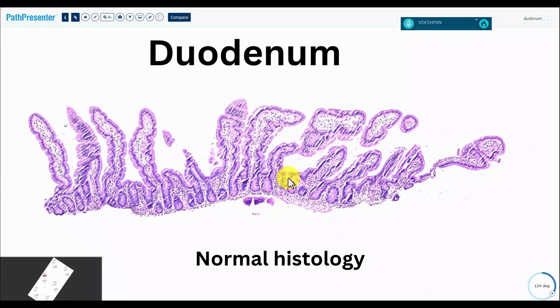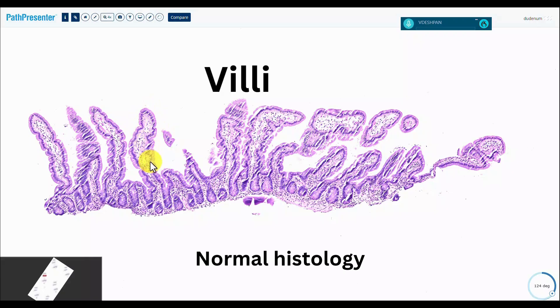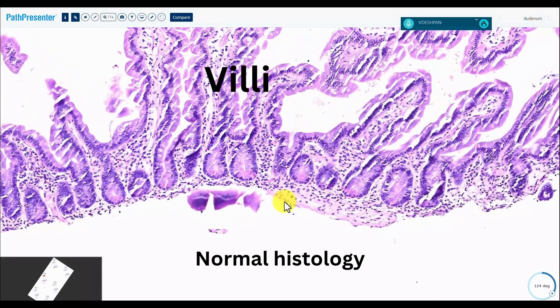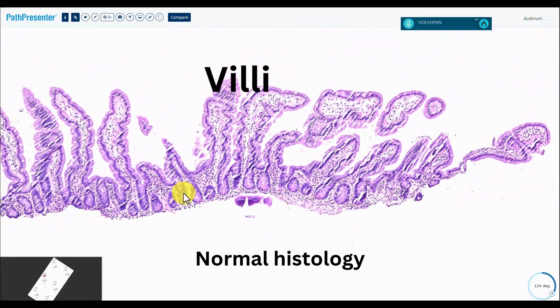You have the villi, which look like finger-like processes. These are the crypts down here, and there's muscularis mucosae — only a sliver of muscularis mucosae.